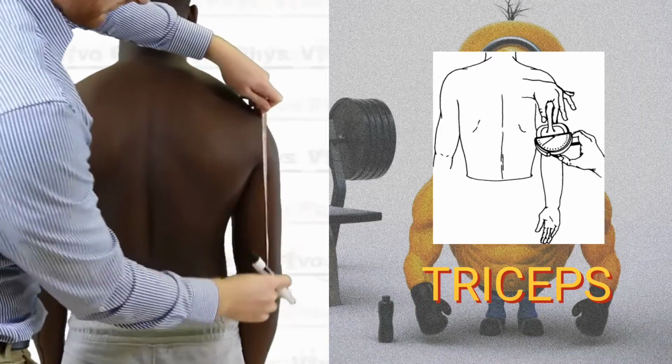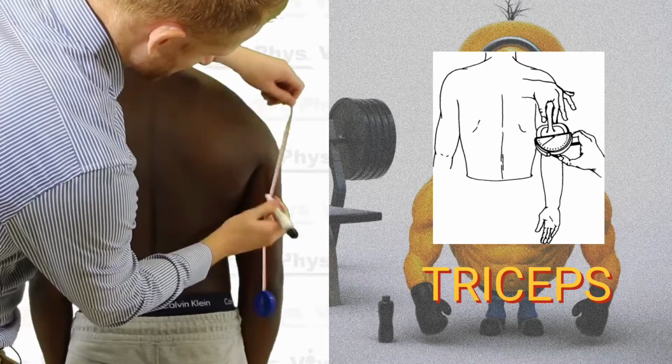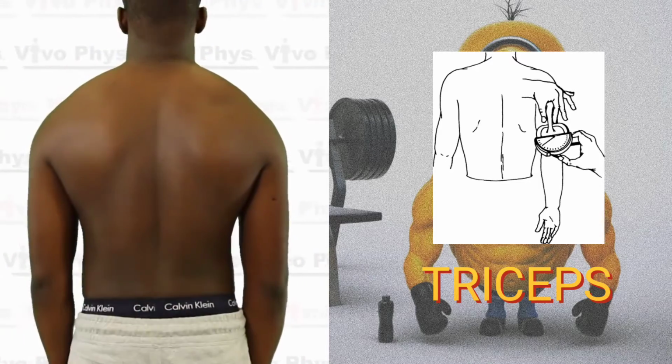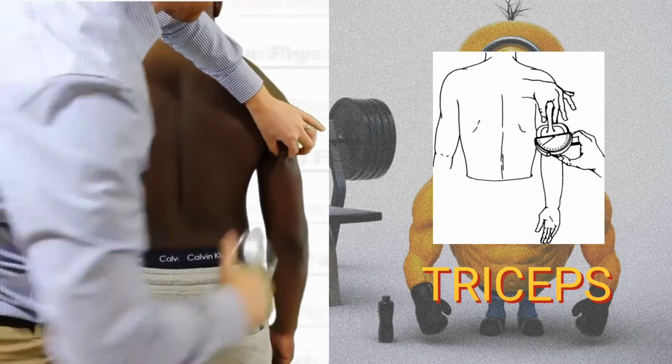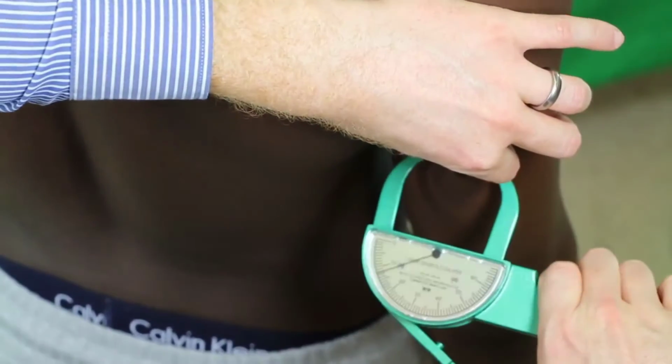The triceps skinfold site is going to be halfway between the olecranon process of the elbow and the acromion process of the shoulder, and it's going to be on the midline on the back of the arm. All right, so midline of the back of the right arm, and this is a vertical fold.